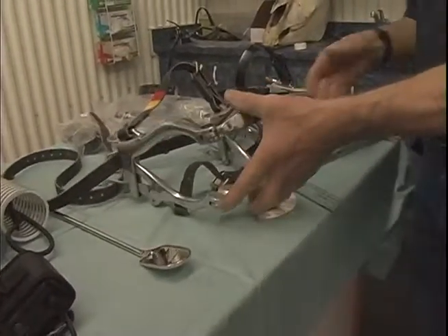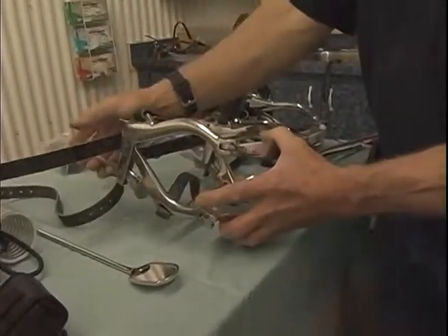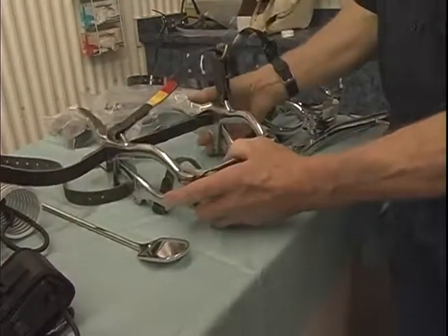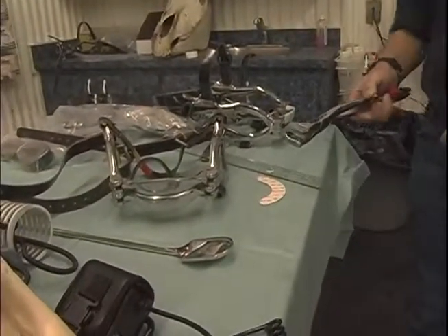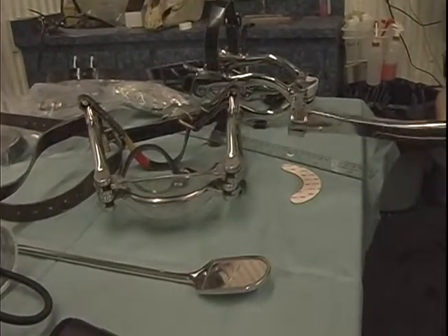This particular speculum can be difficult to open on the last notch for some people. Even though this one opens more easily than most McPherson or Houseman type speculums, some people have trouble getting it open to the total depth.